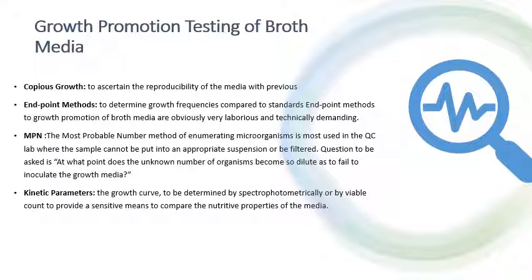First of all, at 0 time, that is the time of inoculation. After 1 hour, then we check 60 minutes, then 120 minutes, then 180, and so on. So from 0 time to 1 hour, 2 hours, 3 hours. So this growth is now measured, how the organism is growing, how supportive the broth is to allow the organism to multiply. The cultures are enumerated and plotted.